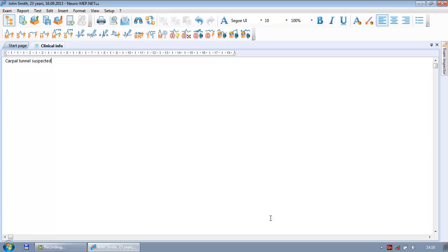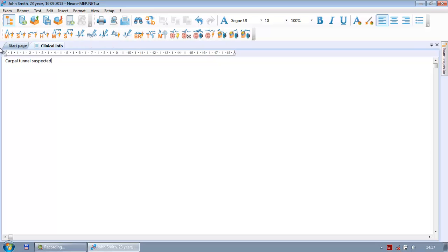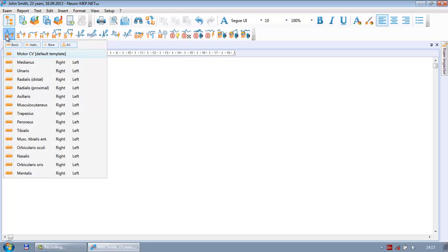Now we are about to start. In the toolbar you can see the list of tests available in the software: M wave, S wave, F wave, H reflex, motor inching, sensory inching, and needle exams. We will start with M wave — press here.